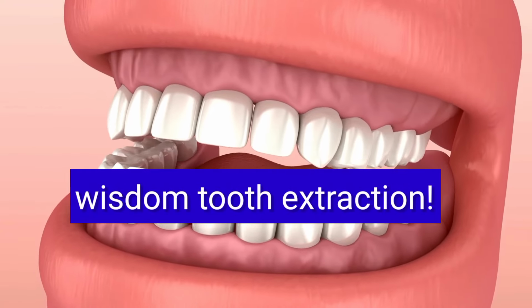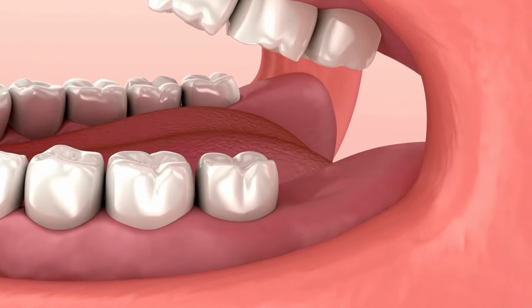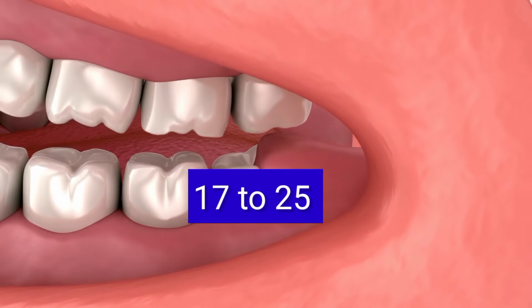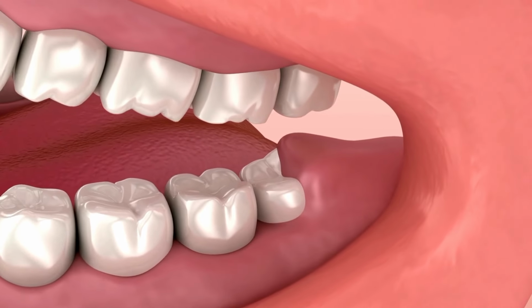Wisdom tooth extraction. This is a common surgical procedure where one or more wisdom teeth, located at the back of your mouth, are removed. These teeth, also called the third molars, usually come in between the ages of 17 and 25 and are the last teeth to emerge.